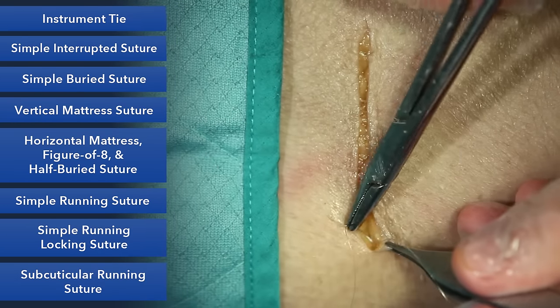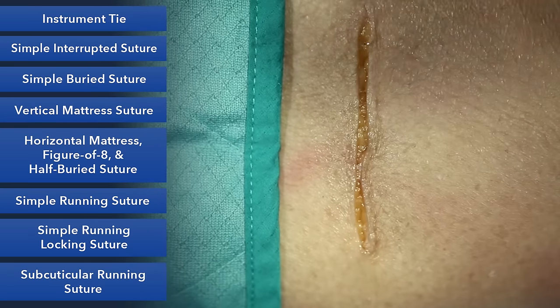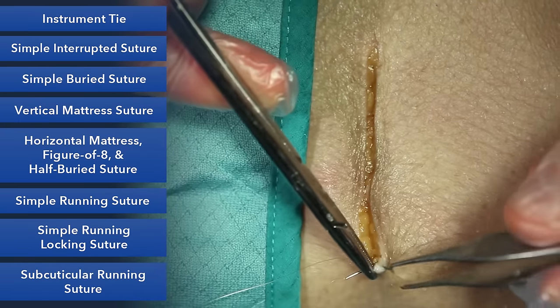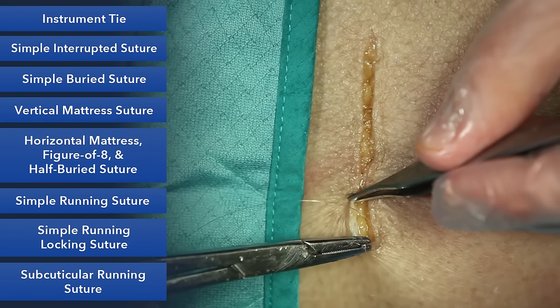Now the knot is deep, so we're going to go deep and then we're going to come superficial. And that brings us right up to the corner. And this is where we're going to start our subcuticular run. When you start or get close to a corner, definitely recommend smaller bites to start. See, I'm just within the dermis, a horizontal bite. We'll need to advance a little bit on the other side and take another small bite, again, stay well within the dermis.